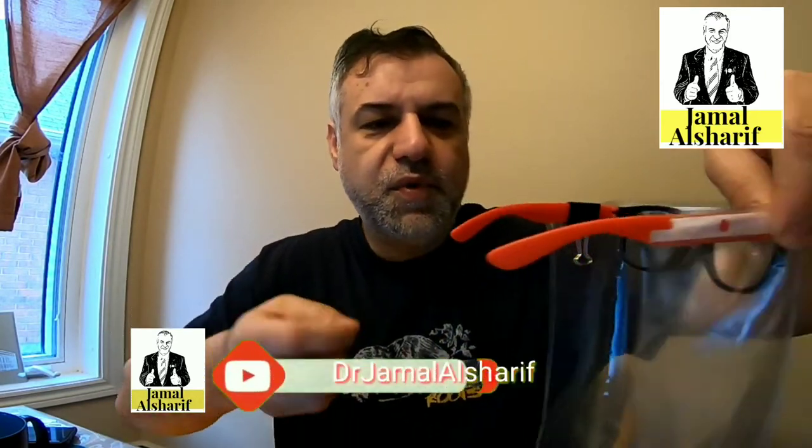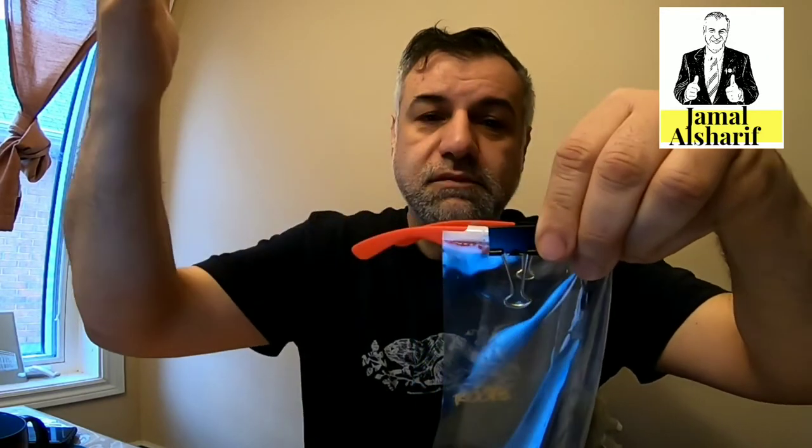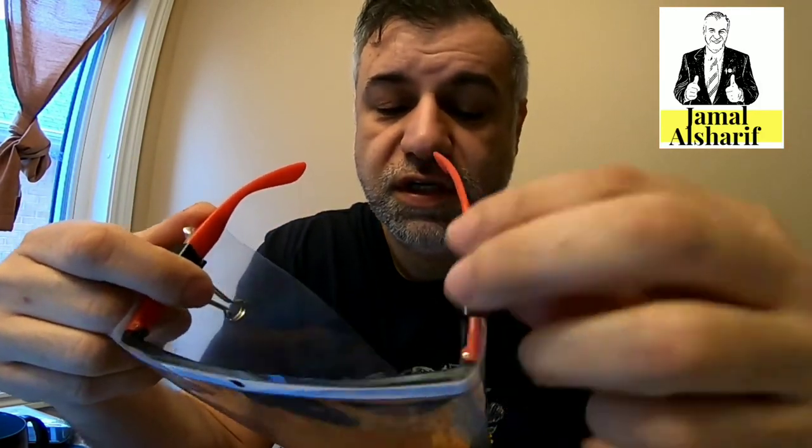Then I brought these glasses — usual glasses. I got them and took off the lenses; they were originally sunglasses. Then I put a clip to attach the shield — you can glue it if you want. The clip makes it easy to reverse and change the shield when needed.